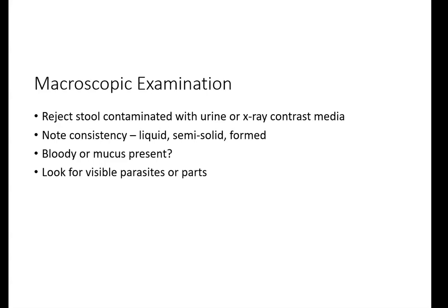Other places do them on the formed stools, it depends on what your policy is at your place. But then you're going to look for whether it is liquid, soft or semi-liquid, semi-solid, or completely formed. So, as the veterinarians tend to say, liquid is liquid. Semi-solid or soft looks like a cow pie, and formed looks like a tube. Doesn't matter if it's a hard tube or soft tube, as long as it looks like a tube, it's formed.